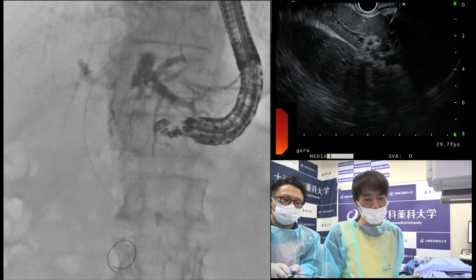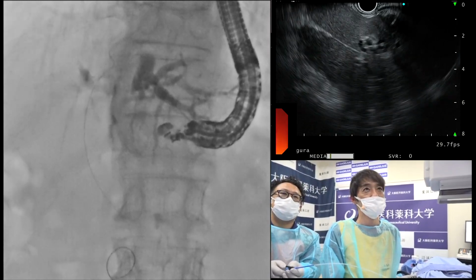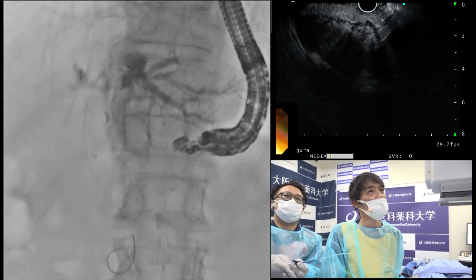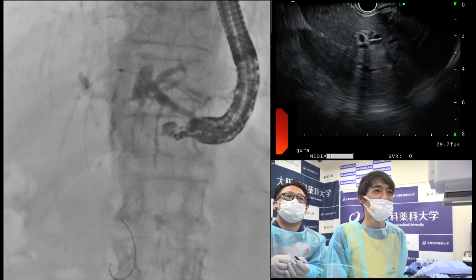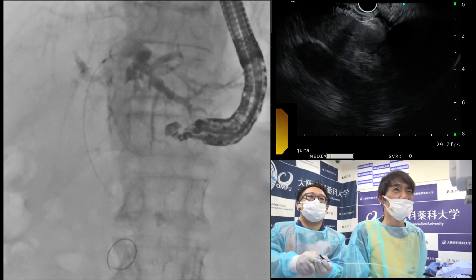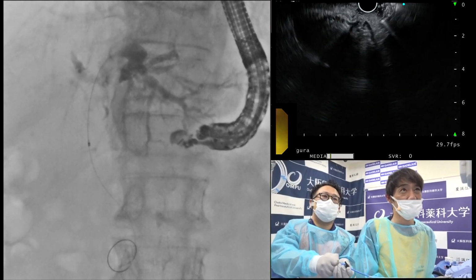Today I will deploy the Zilver 635. Oh, very strong. This patient frequently experienced cholangitis, so the biliary tract is relatively hard. But we successfully inserted the catheter.